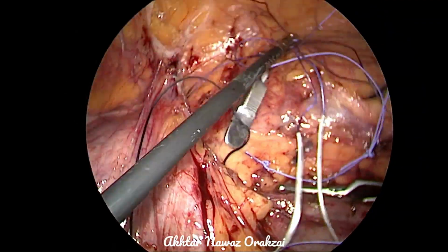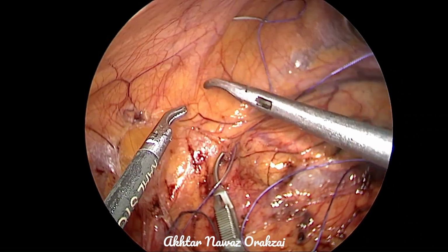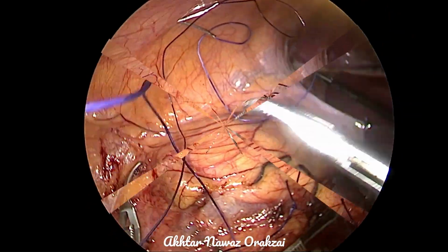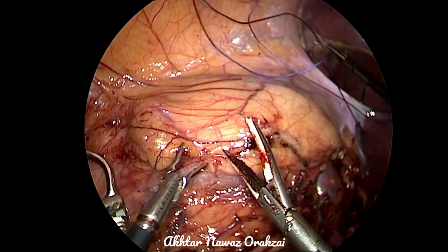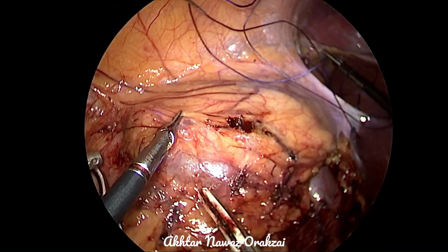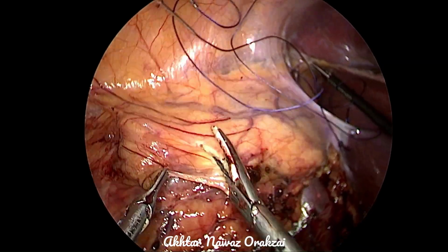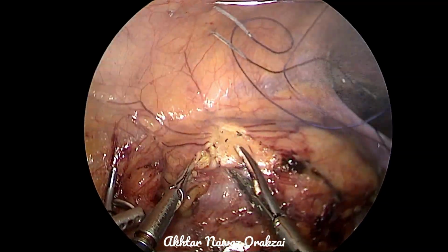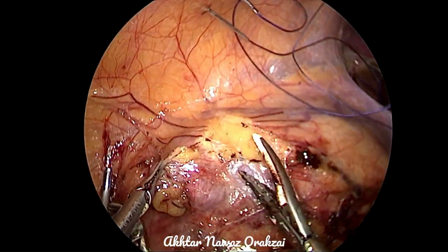And then we place 3 sutures, one Vicryl 2-0 and 2 Vicryl 1, and we place them well attached to the anterior abdominal wall, so that once we clamp the artery, we do not lose time looking for the sutures and getting them into the peritoneal cavity and all that. Now all the homework is complete.